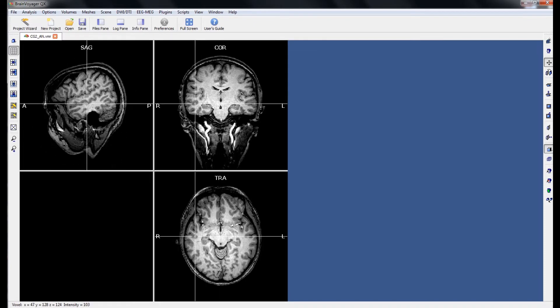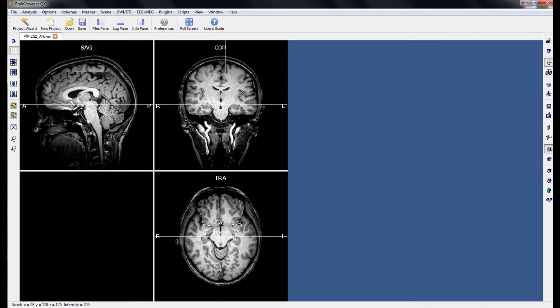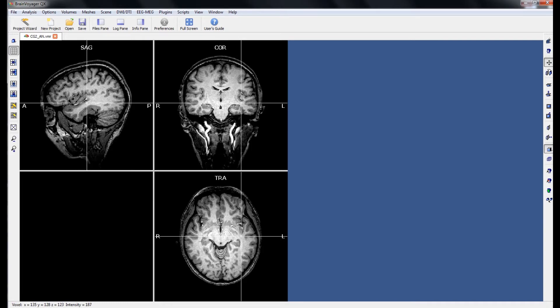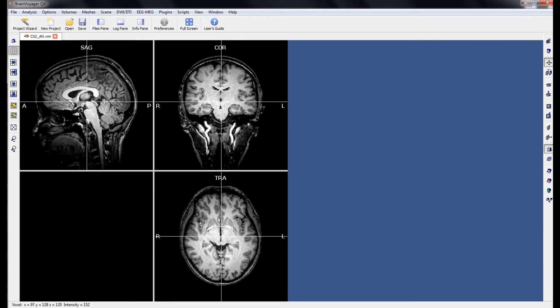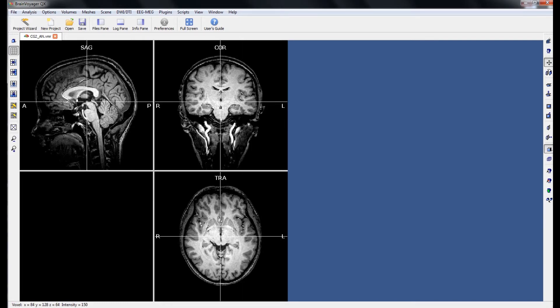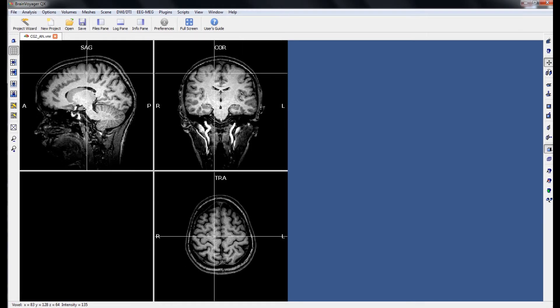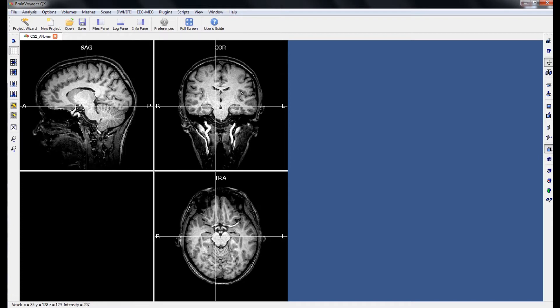You can see what these inhomogeneities look like if you scroll through the brain. You can see particularly in the white matter that the front of the brain looks much darker than the middle and the back, and also the top of the brain is much darker than the bottom of the brain. The goal then becomes to reduce the range of values that white matter can take, and also to reduce the range of values grey matter can take.